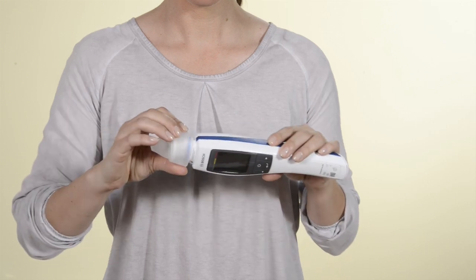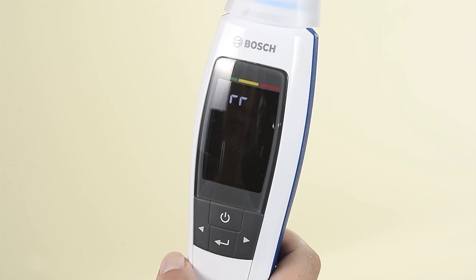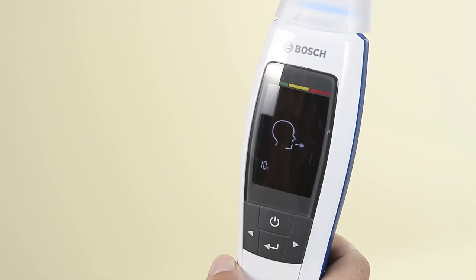Once everything is ready, you can move on to the next step. Press Enter to start the phase in which the device is prepared for the measurement. When the device is ready to go, the symbol for exhaling appears. You can now take the measurement.